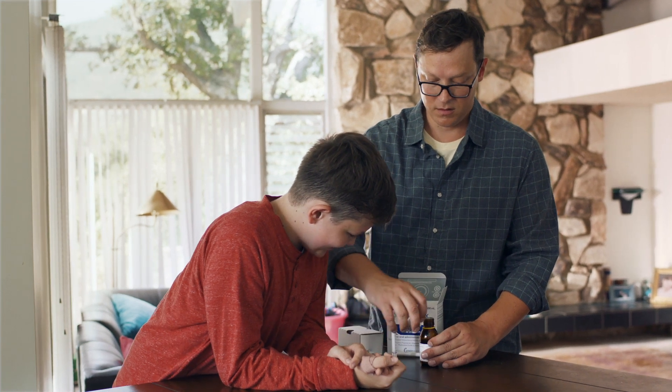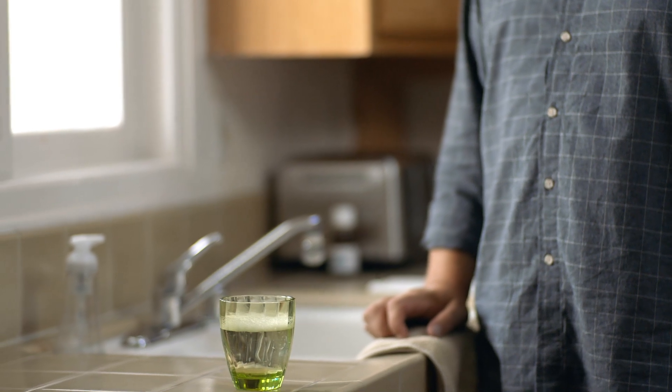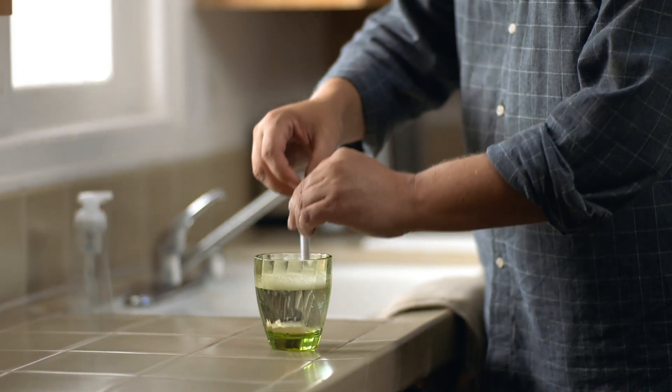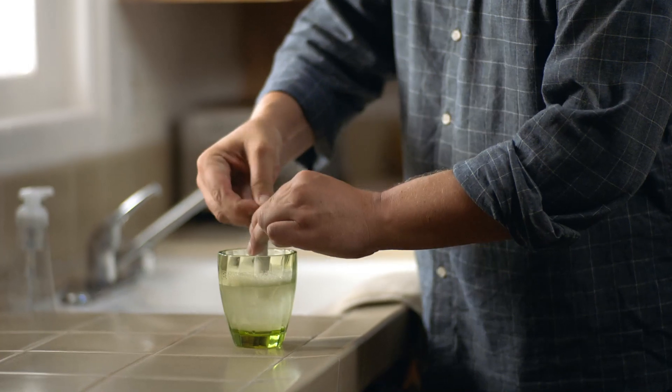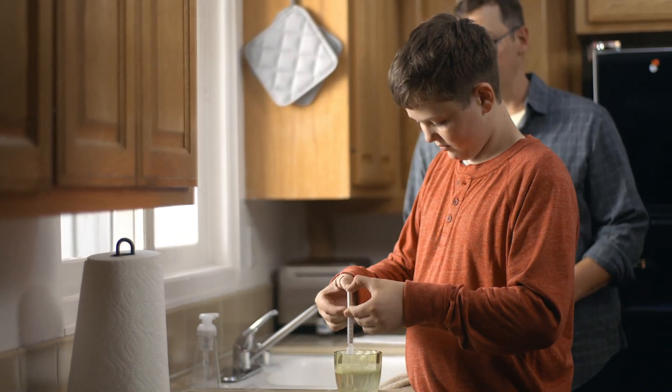For the cleanup, all you need to do is screw the child-resistant cap back on over the bottle adapter. Then fill a cup with warm soapy water to clean the syringe. Once you've got your cup, just draw the water in and out of the syringe with the plunger until both are clean. Sometimes Cameron likes to help me with this part.